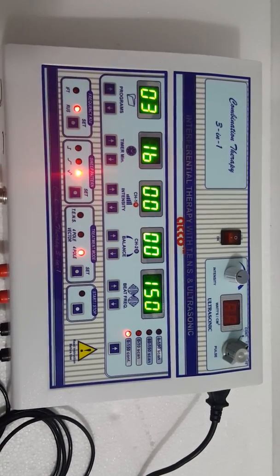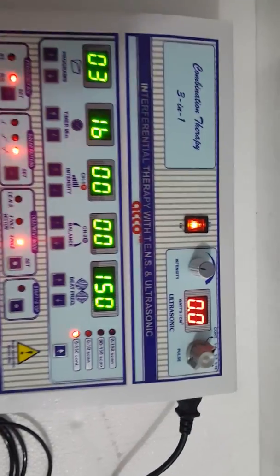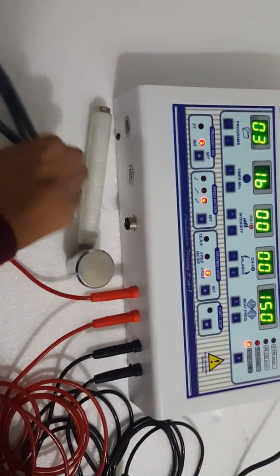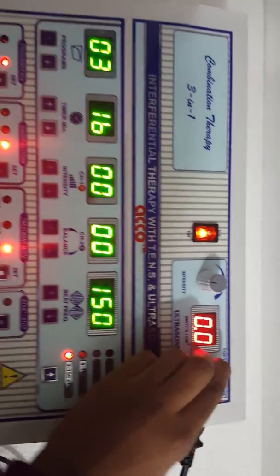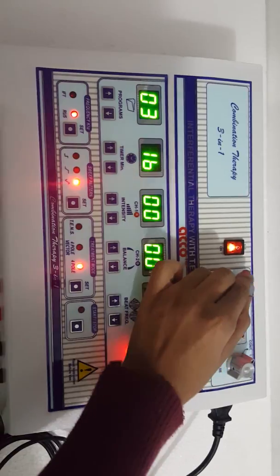Now I will show you the demo of ultrasound therapy unit. Switch on the ultrasound therapy unit. Attach wire and pass the handle. Now set the mode as per your need — continuous or pulse. Now increase the intensity as per your need.